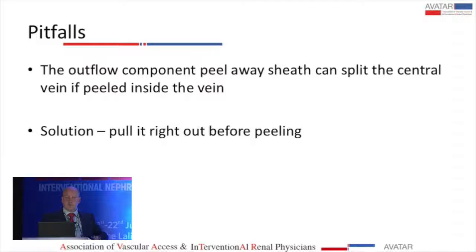The graft also crosses a joint. Now, all vascular surgeons know this is another recipe for kinking and twisting, and constant movement can dislodge things. The solution is always to bring it round the convexity. You bring it on the internal diameter, you'll get kinking. You bring it on the external, instead of compressive forces, you get stretch across it. So this is what he's done here.